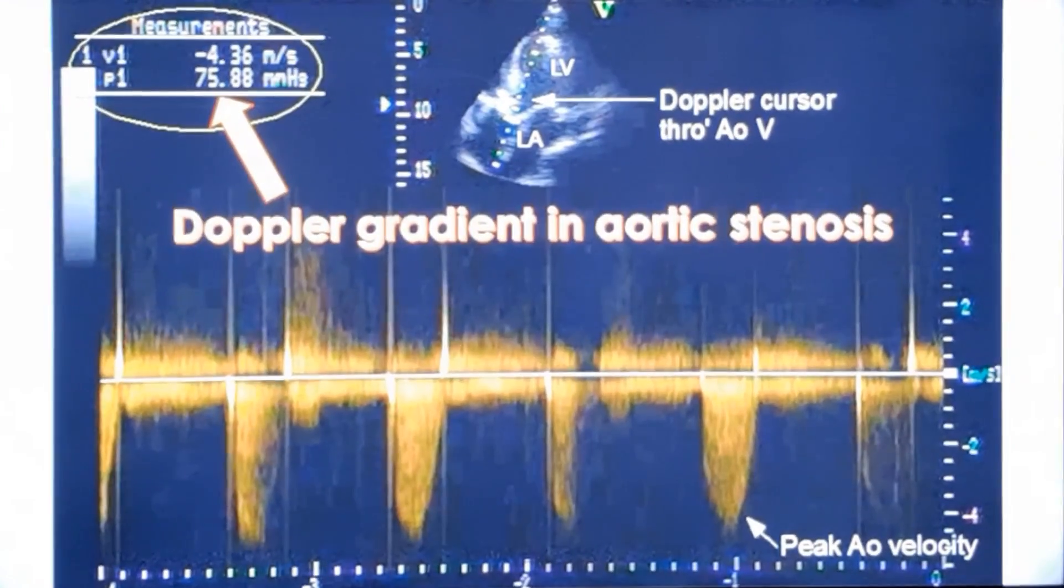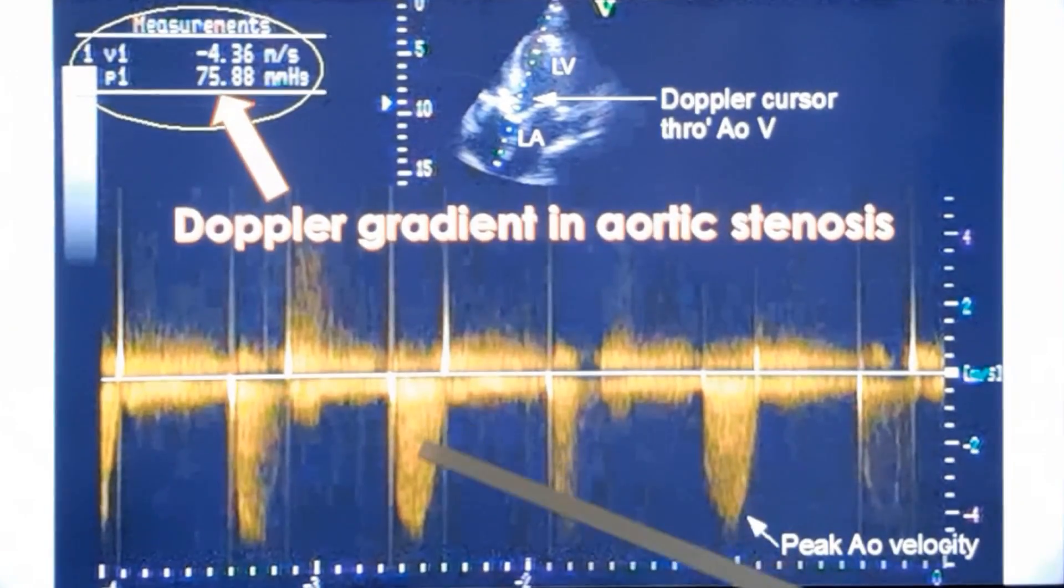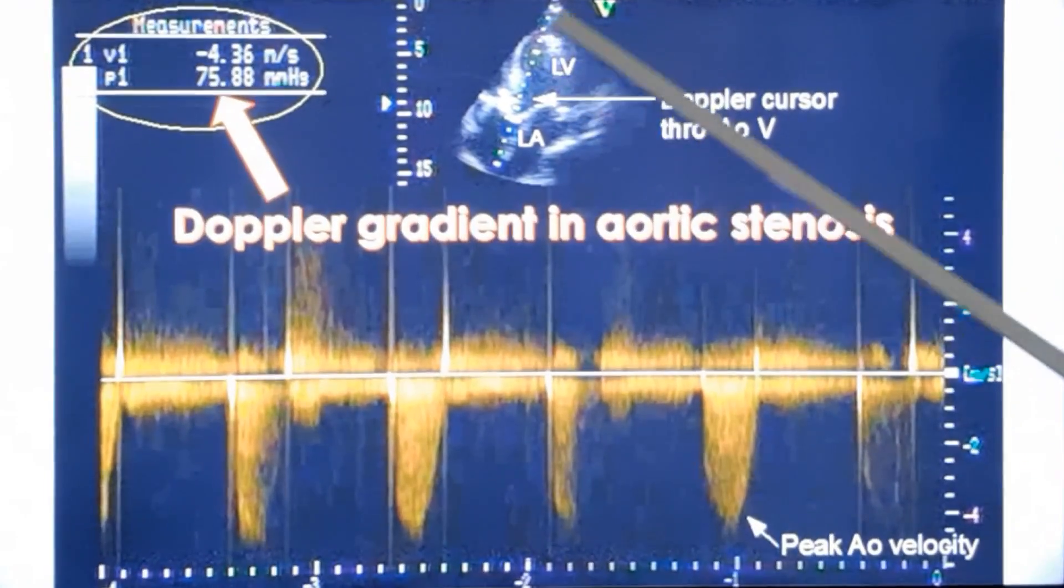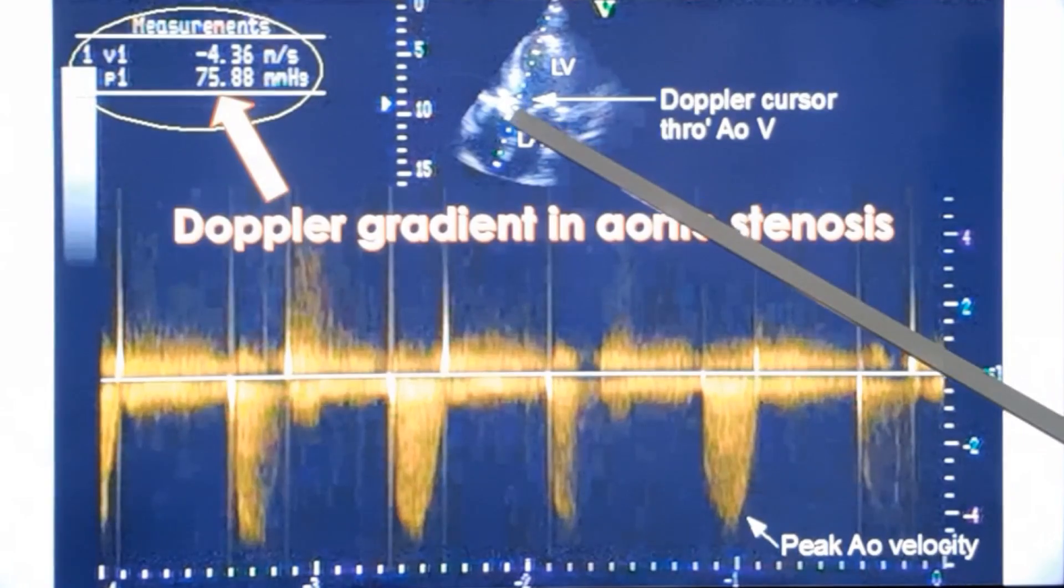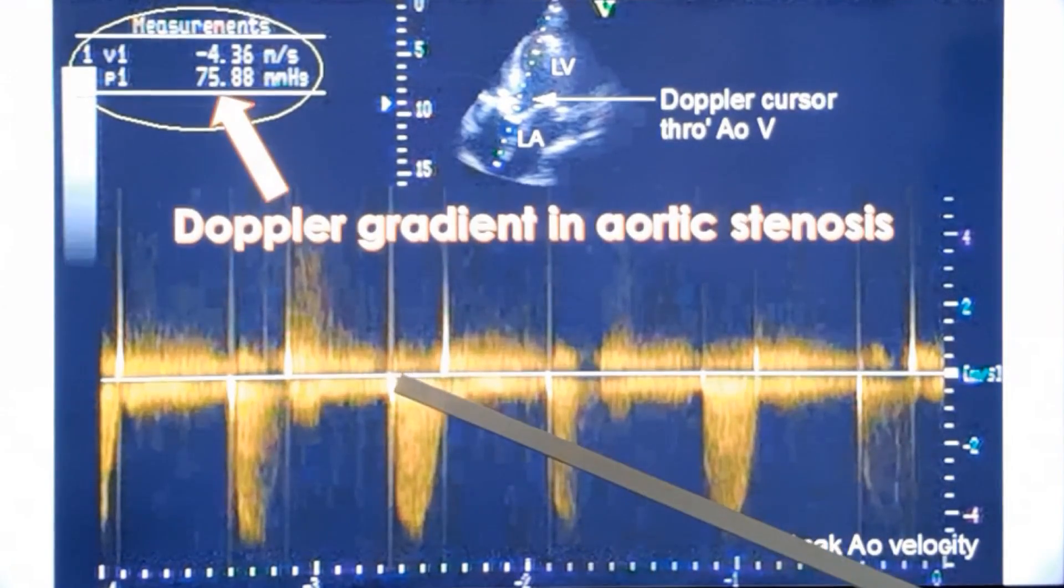This is how gradient is measured in Doppler echocardiography. You can see the aortic tracing taken by continuous wave from the region of the aortic valve, and the peak gradient can be measured. In this case, if you want to take the mean gradient, you should sketch out the outline and then the computer will give you the mean gradient. Here it has not been shown.